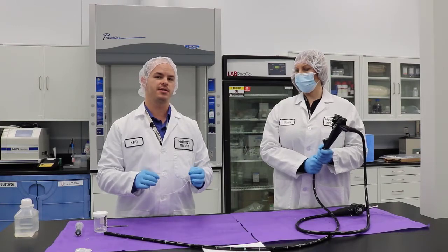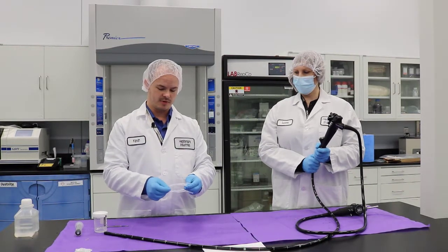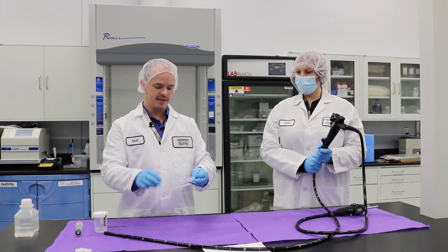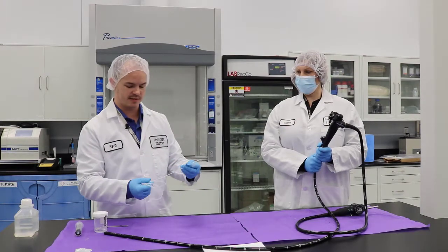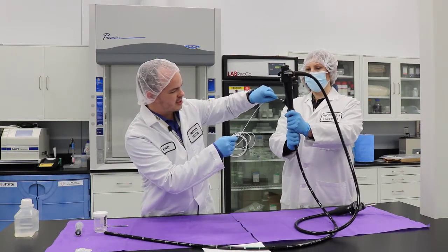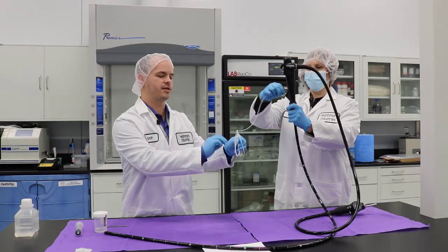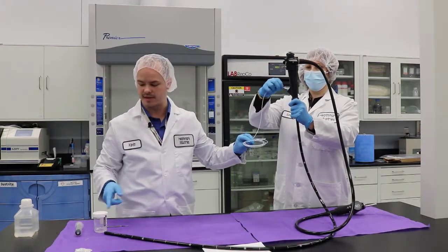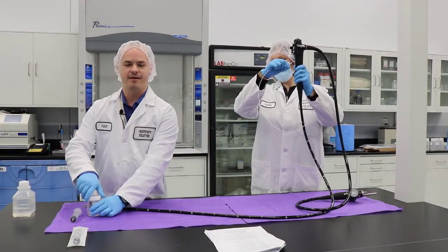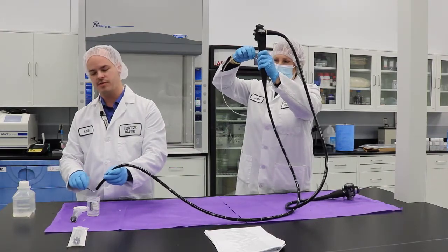For this next step, we're going to introduce our brush into the channel of the endoscope that we're testing. It's going to be a little coiled, so we're going to make sure we uncoil it so that it's easy to use for our facilitator, because they're going to help us with this part. I'm going to go ahead and introduce the brush into the channel to get it started, and she's going to take over with the handle as we continue to advance it down to our container. Our facilitator is going to continue to push the brush through the channel as I present it into our sample cup.